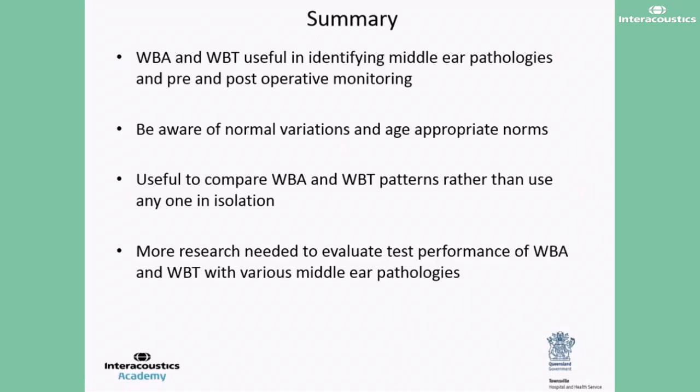interpreted in isolation. They should be combined along with other audiological measures such as the air-bone gap, etc. As we have seen with clinical examples, both the absorbance at ambient and pressurized conditions are useful in identifying middle ear pathologies and pre- and post-operative monitoring. They provide very useful information that improve accuracy of identification of middle ear pathology as well as monitor the middle ear function for progress or any improvement of the middle ear disease.